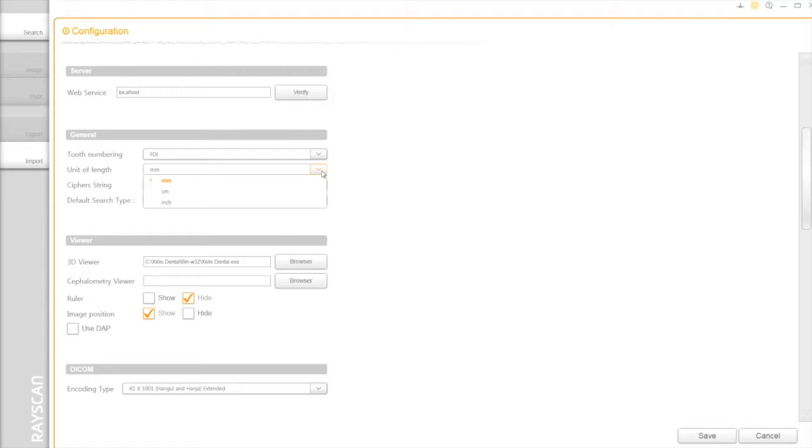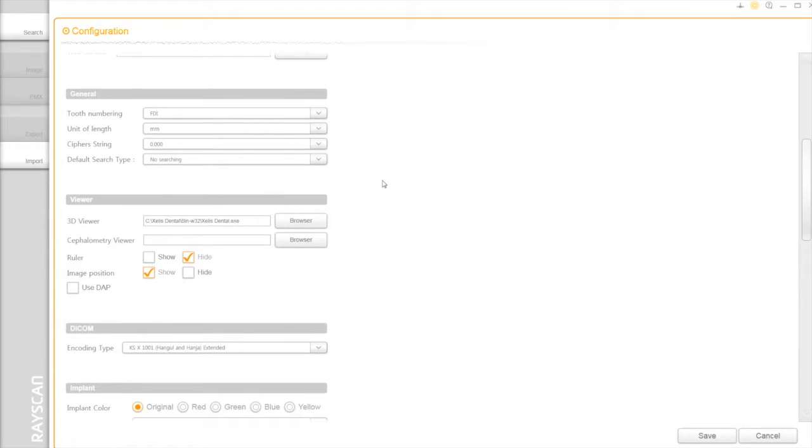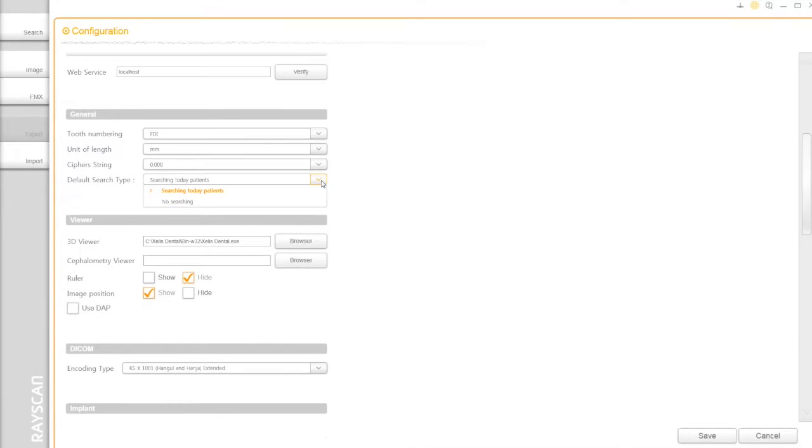The default unit is millimeter, but you can change it any time. Below that, you can select the search type either today or no search at the beginning.